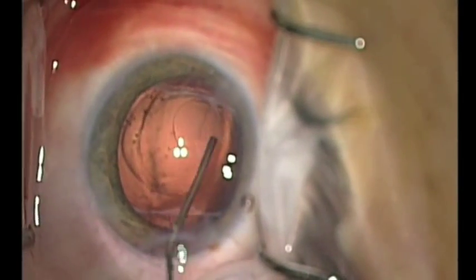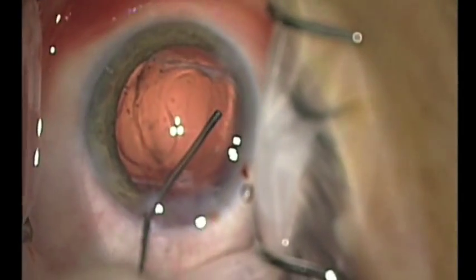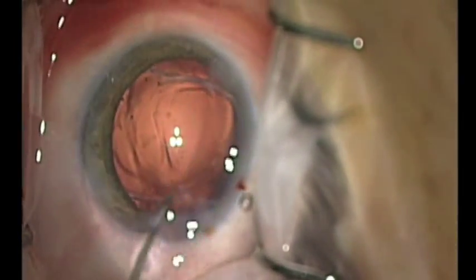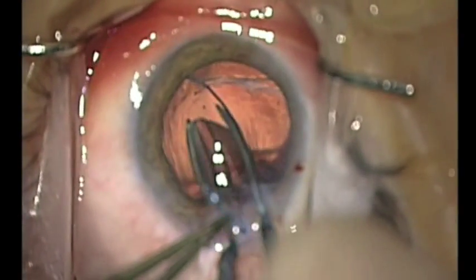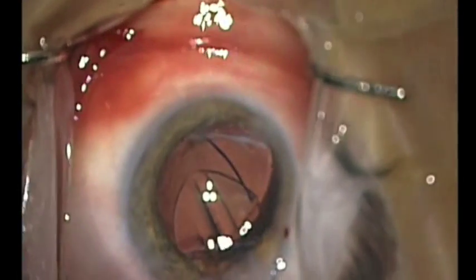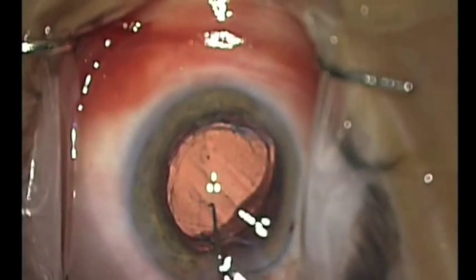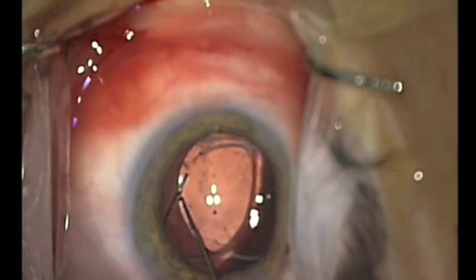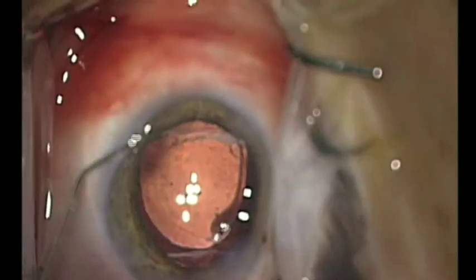More viscoelastic is then used to inflate the capsular bag and deepen the anterior chamber. A three-piece intraocular lens is used with the leading haptic placed into the capsular bag. The optic is then positioned into the capsular bag and the trailing haptic is then dialed into the capsular bag.